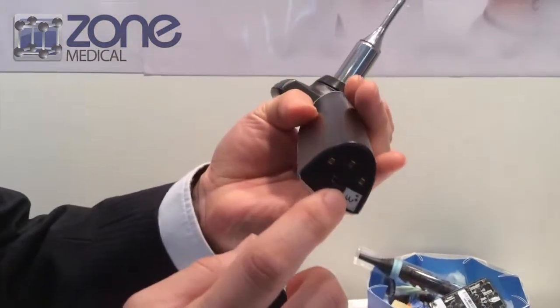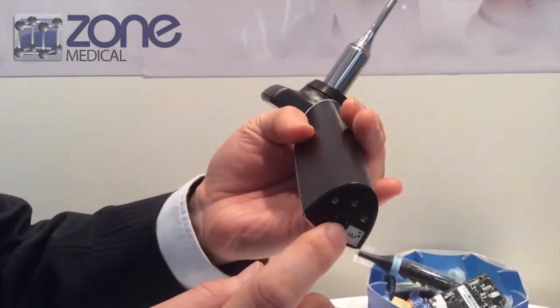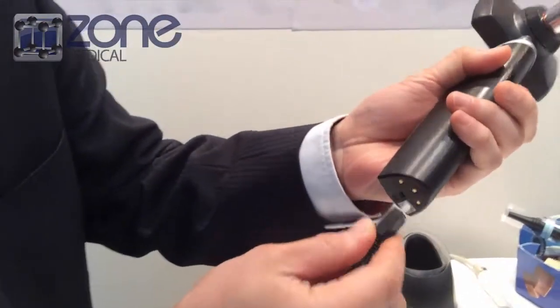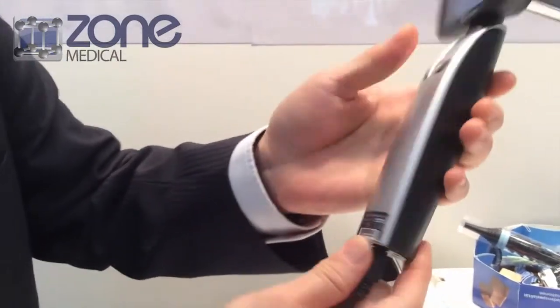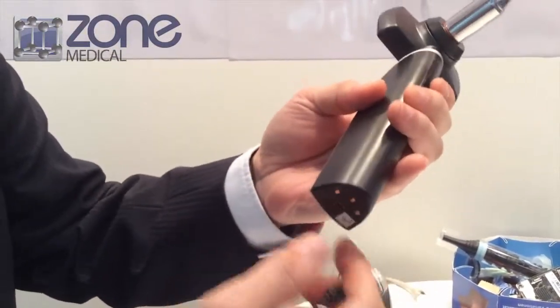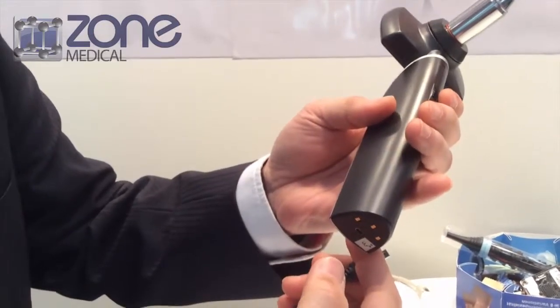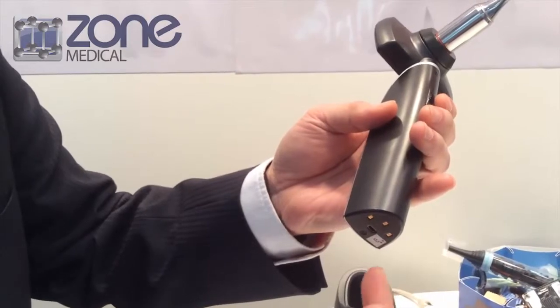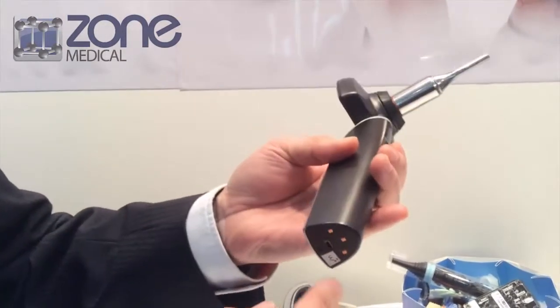There's a micro USB port here — you can connect it for charging, direct charging, and you can output to a bigger screen. You can also retrieve files from a PC or Mac directly.